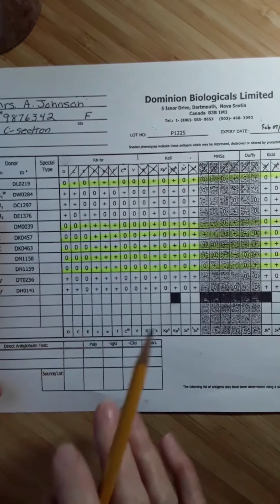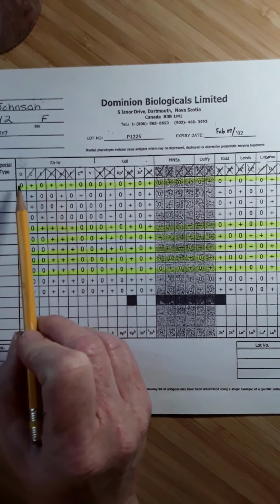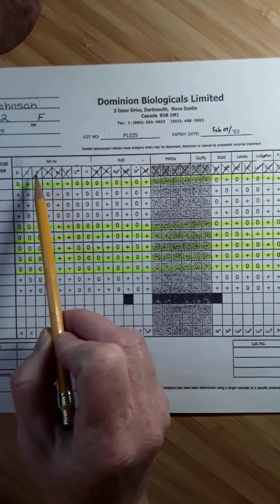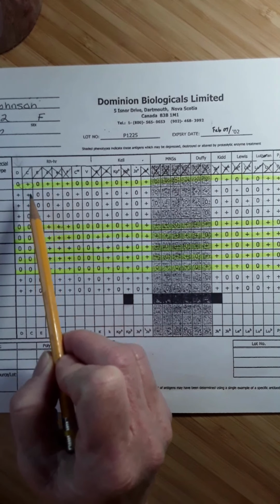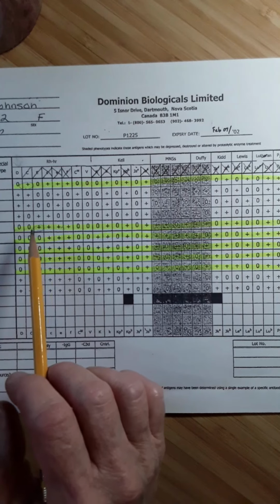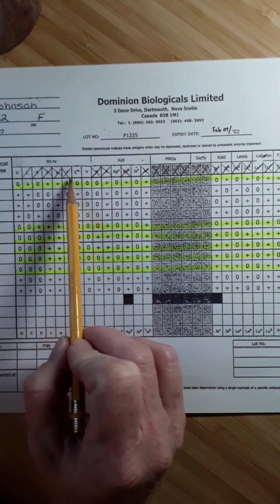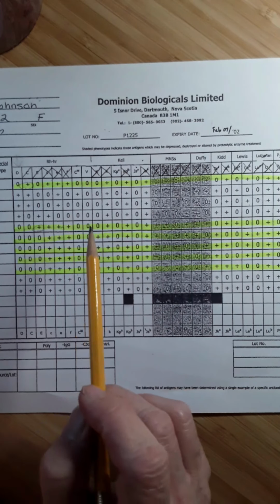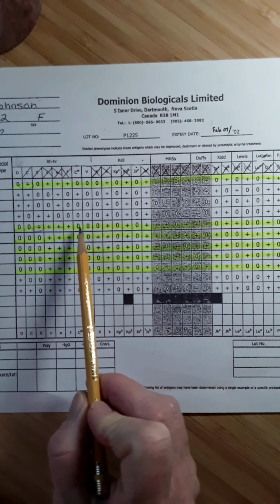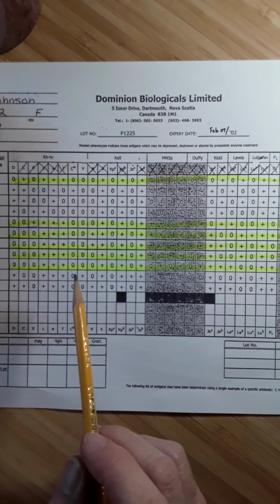We started out looking at the D, and we weren't able to put any slashes across it. For C and E, we had one slash because we were able to find one panel cell that was positive, yet it did not react. Then we were able to double cross out little c, little e, and little f. I found that I could not cross out CW or V. There were no positive cells for CW and V that did not react, so I can't exclude them.